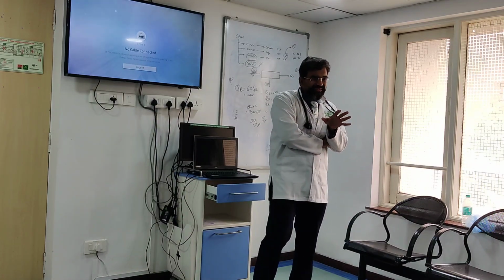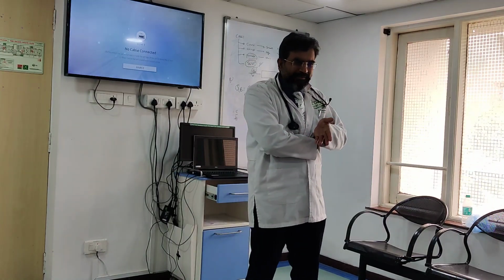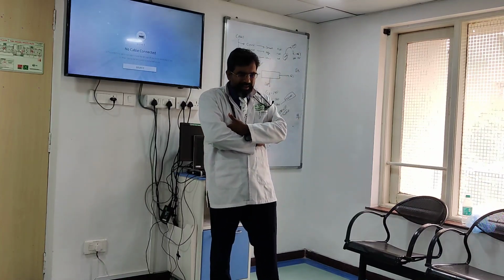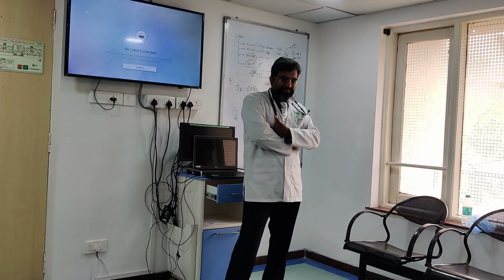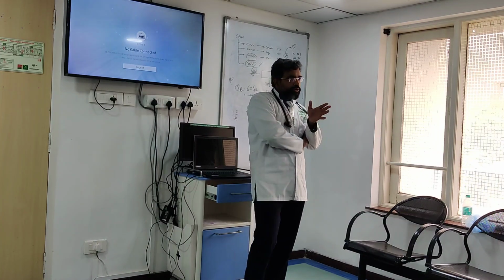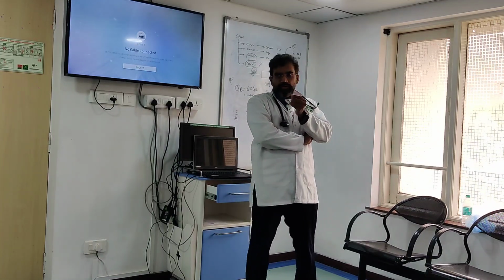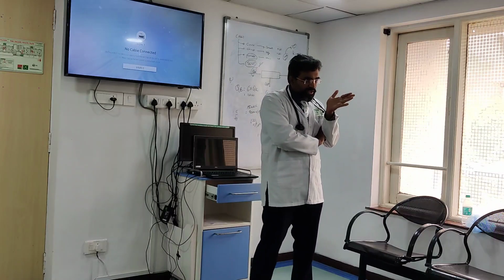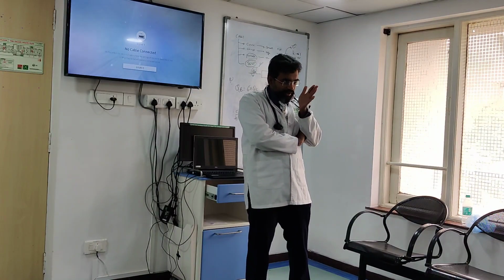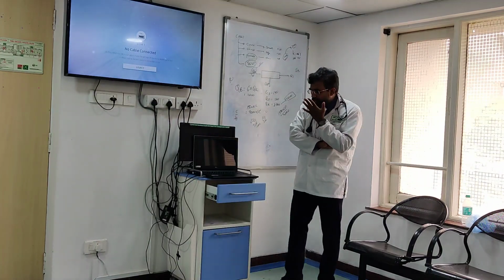Why would you want to do CRRT? If you can afford to do 450, this patient is not a candidate for CRRT. This patient you can manage with dialysis. You understand, no? I will not want to use that at a higher amount. So now, tomorrow if your TMP goes up, that means the membrane is becoming more and more clotted. You are going to keep a watch on these membranes. Now you understand what is happening. Filtration fraction you can figure out. So now you will understand why it is pre-filter.